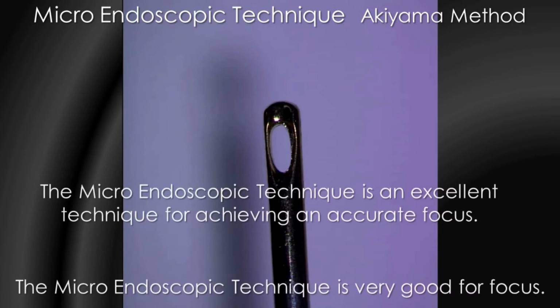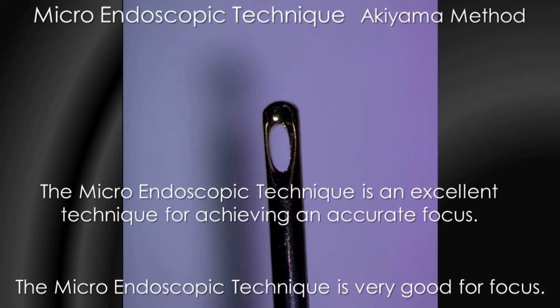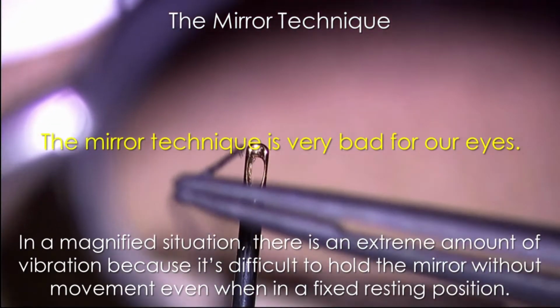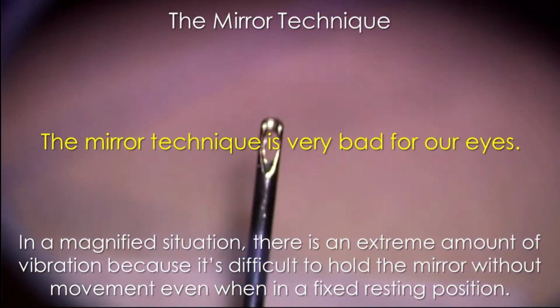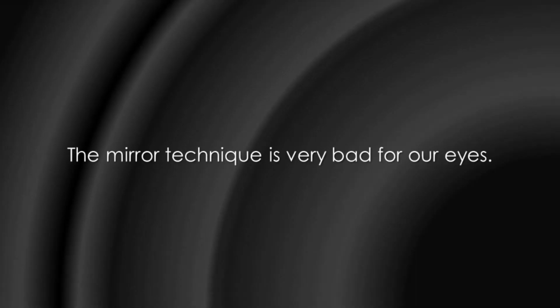This is the microendoscopic technique. The microendoscopic technique is very good for achieving an accurate focus. This is a mirror technique. In a magnified situation, there is an extreme amount of vibration because it is difficult to hold the mirror without movement even when in a fixed resting position. The mirror technique is very bad for our eyes.